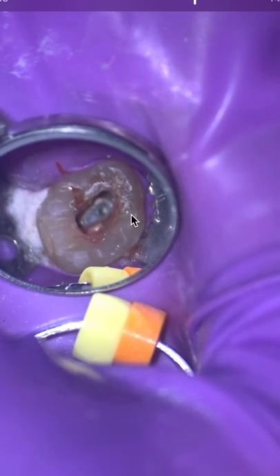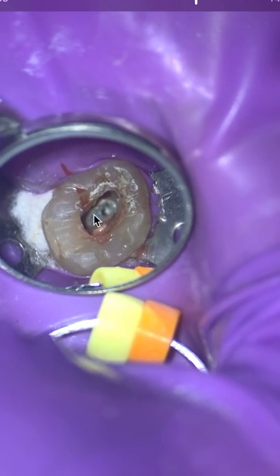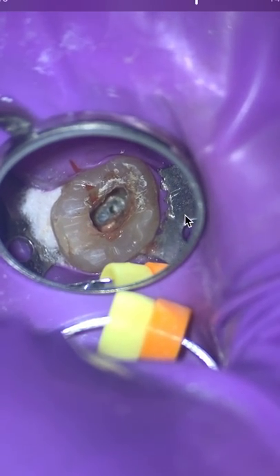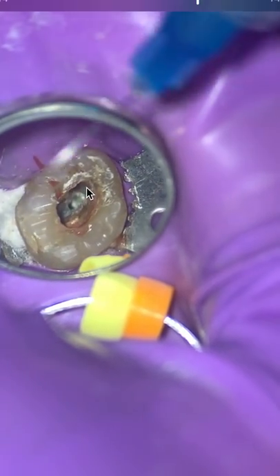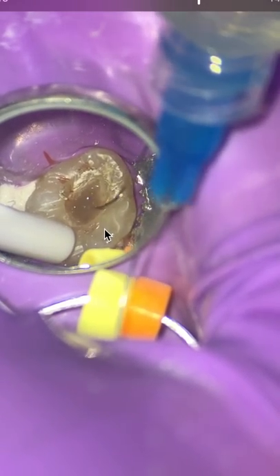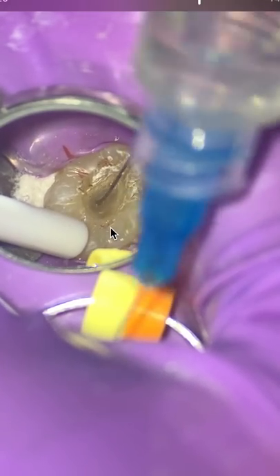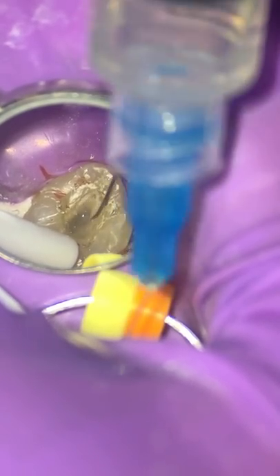So what I'm going to do now is that we've got this bioceramic and hemorrhage product mess. We're going to irrigate this just like regular. We're going to irrigate all that out. You can see, actually, what's really helpful about putting the BC sealer in is that it lightens up the orifice, so I can actually see more of if there's a bifurcation. It helps. But I'm going to spend a lot of time irrigating this case out.